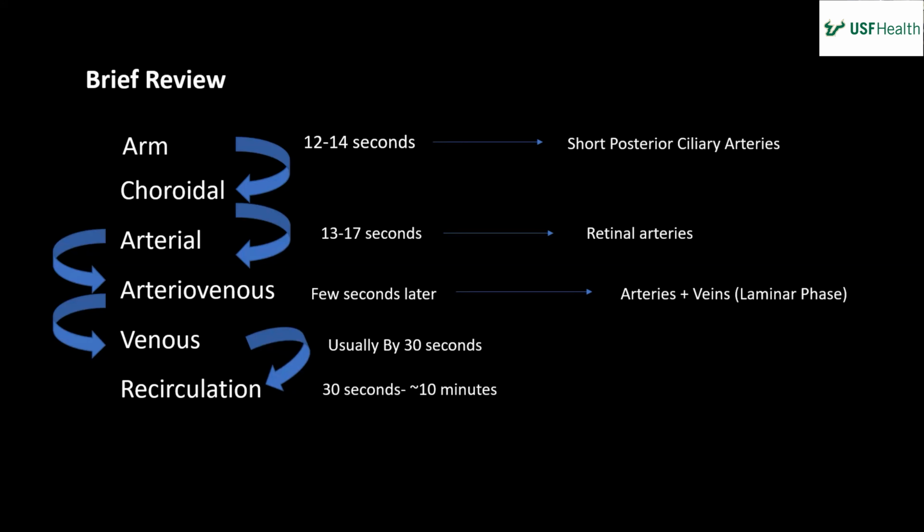Is that why you consider it not necessarily ethical to get the repeat? Oh, fluorescein, well, because you're sticking something into their arm. There's a risk. Yeah, there's a risk, and life, that's other things. Yeah, I mean, it's totally unnecessary, but I was excited, I was like, I'd love to, and he wanted to see it. I was like, you're the patient, do whatever you want. So he wanted to see it, so we got it, so I think it might be writeable. Heidi and I are gonna see if we can find a place to put it, I think it's an interesting case.